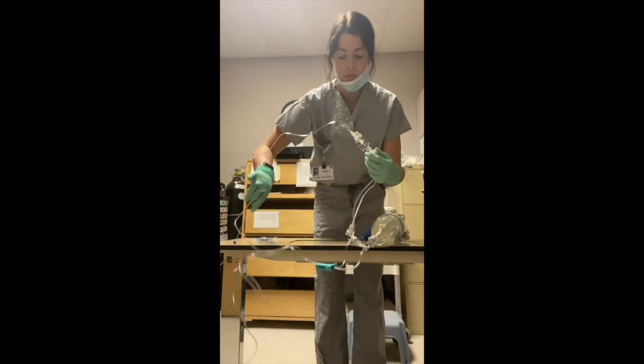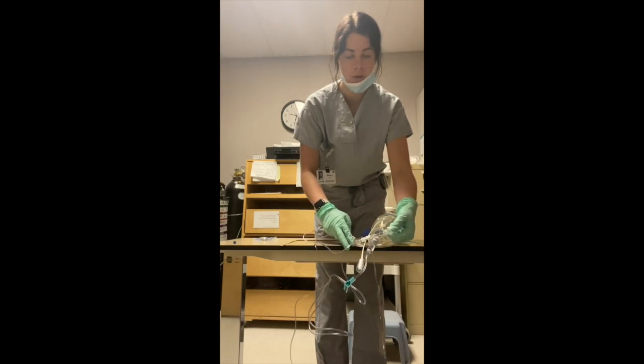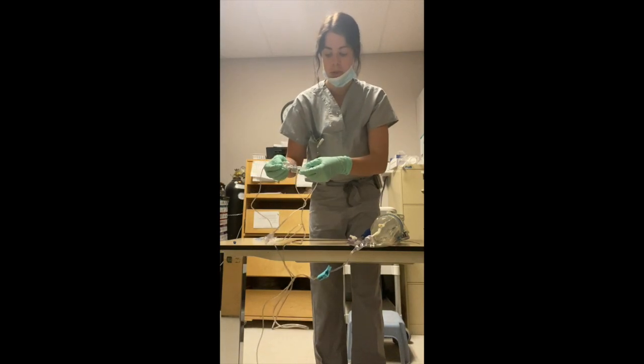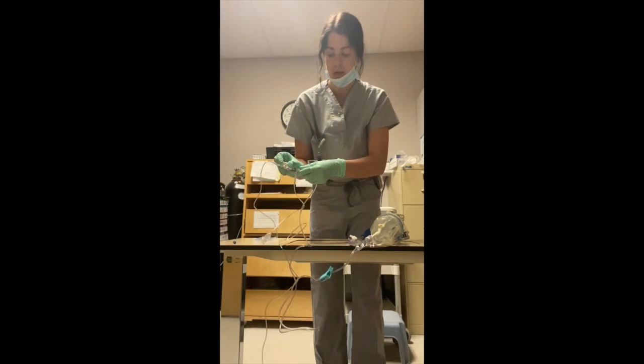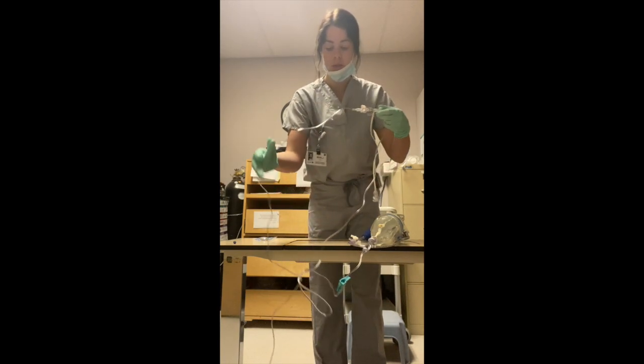And then we're going to flush it to get all the air bubbles out. And once all the air bubbles are out of that portion, we're going to switch it back off and continue down the line.